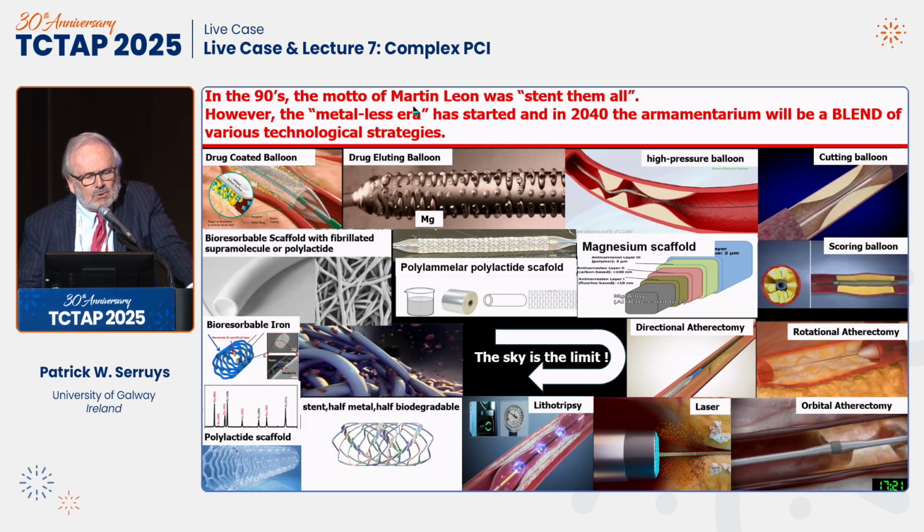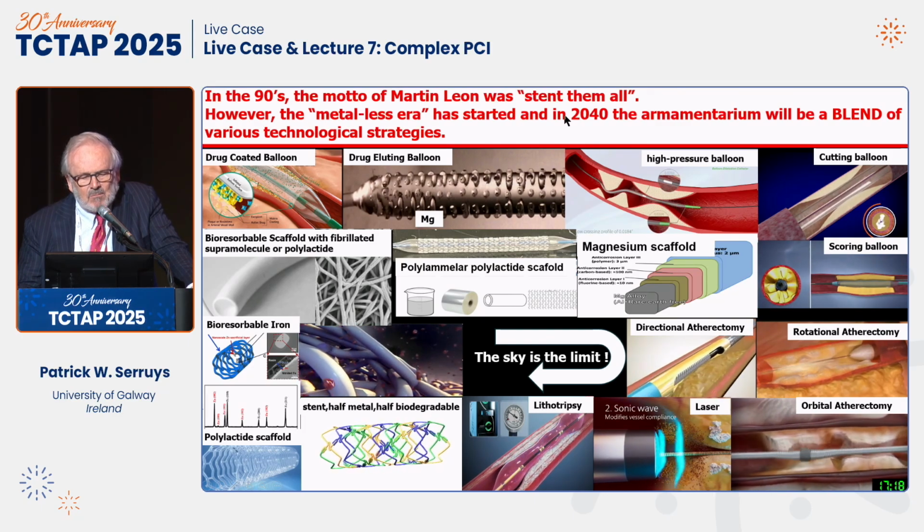In the 90s, the motto of Marty Leon was "Stent them all."